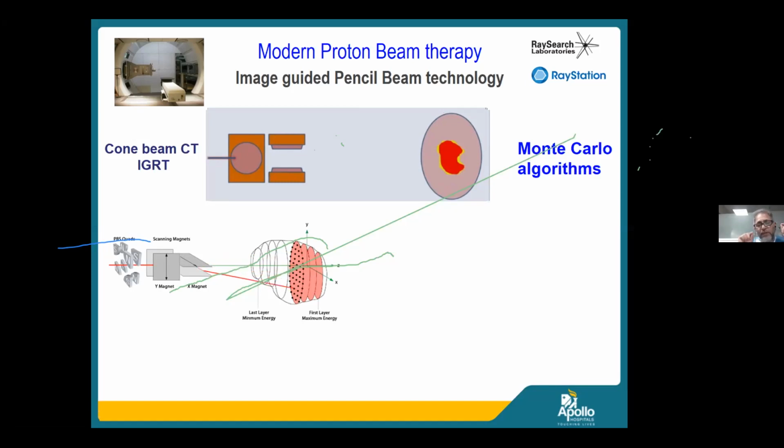MeV. We call it million electron volts, MeV, such that whatever is the normal human body in any part of the world, whether it is a superficial tumor or the deepest seated tumor in the abdomen or the pelvis or the liver, or a retroperitoneal sarcoma, or the spine and the brain, whichever site you name, it can be encompassed. For example, in our center in Chennai, we are very happy to state that in India, we have the state of the art pencil beam technology, which has a range from 70 MeV to as high as 230 MeV. So you can treat practically the whole range, number one.